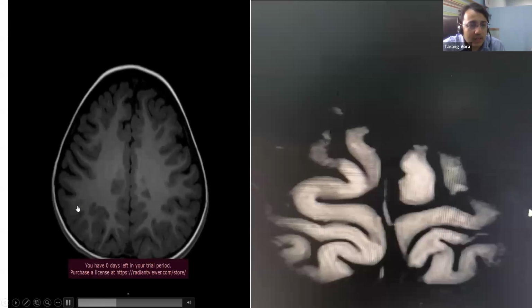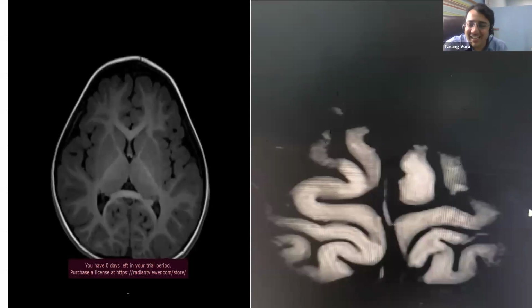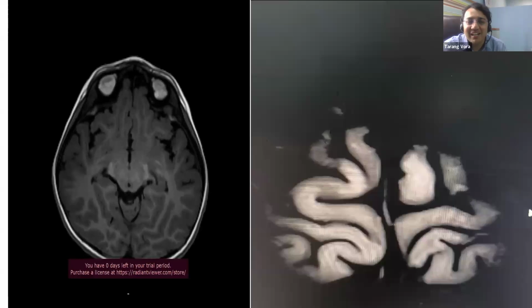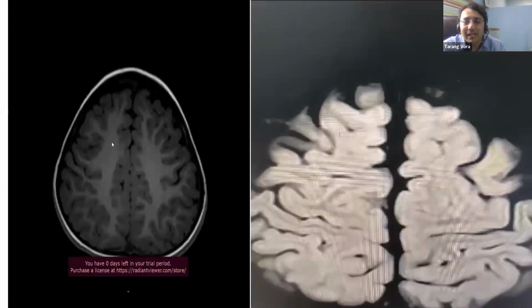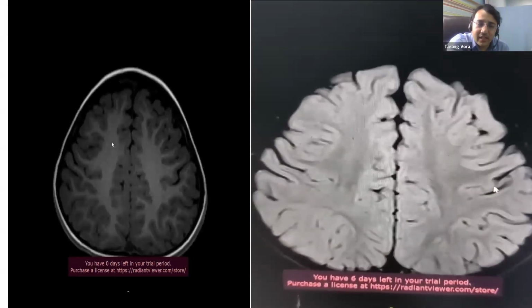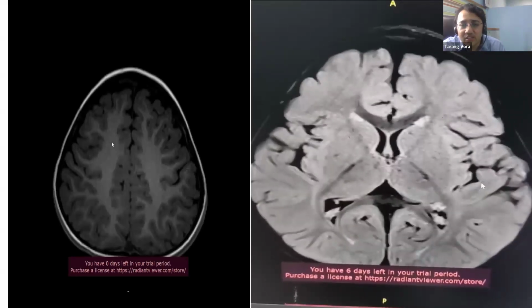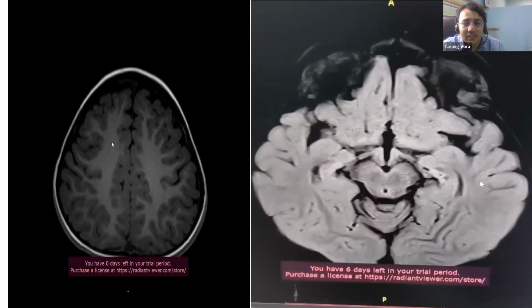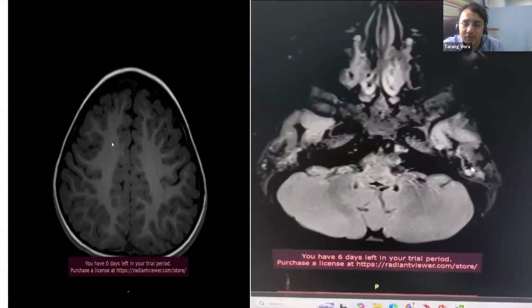You can take a look at how the gray and white matter is looking. For each case evaluation, if you want to look at the MRI, it takes 15-20 minutes minimum to scroll through the MRI to get an idea of how it is looking. The left side was the T1 weighted, the right side was the FLAIR imaging. There is no significant dysplasia noted on the FLAIR as well as T1 weighted images.